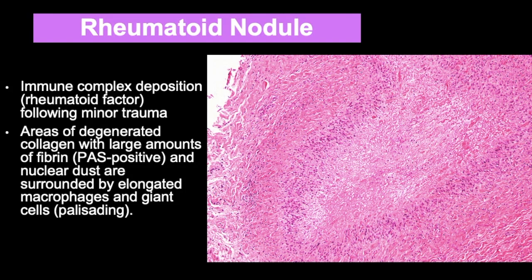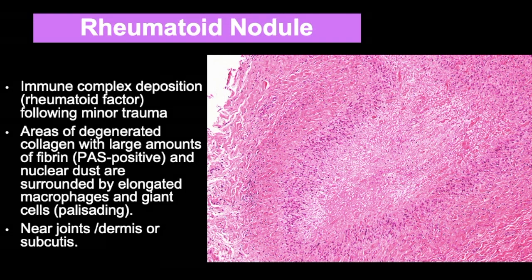So you have two lines you can follow for those Alcian blue. If mucin deposition is increased, you suspect that this is more like GA type. If the mucin deposition is not increased, and also the clinical history is near the joints in a rheumatoid arthritis patient, you suspect this is a rheumatoid nodule.